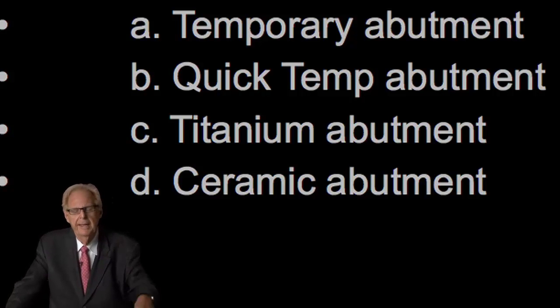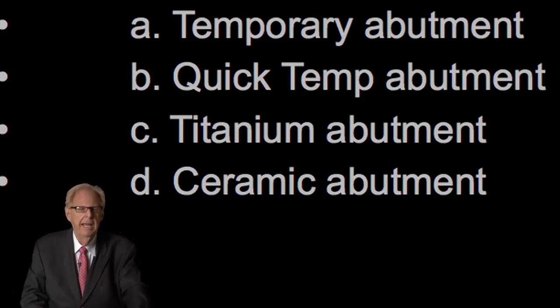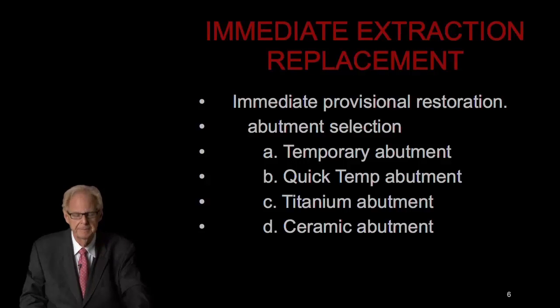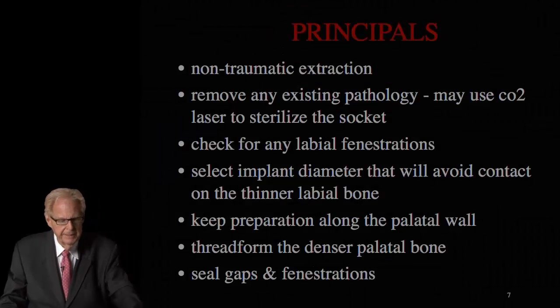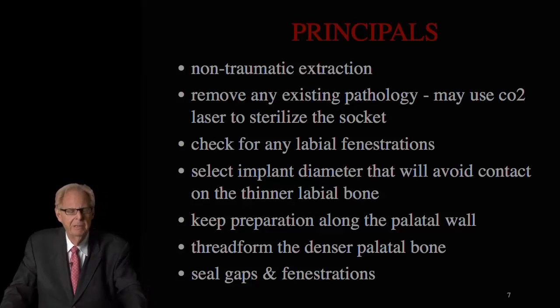We can use a final titanium abutment, or we can use a ceramic zirconia abutment, depending on what you're comfortable with and what you're really trying to achieve. And again, through the presentation, we'll give some different examples. So again, we go back to the principles because it's very important.